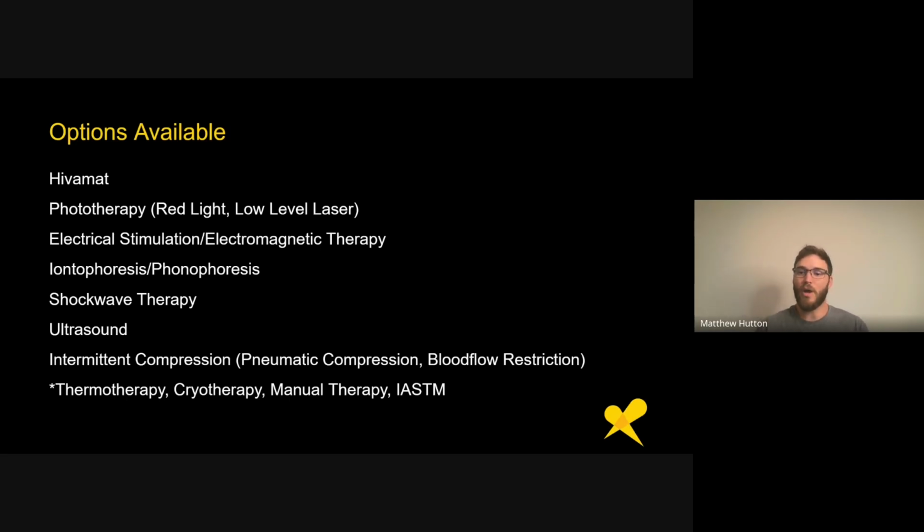If you come in with so much pain and you're like, all I can do is sit on a table, okay, we're not going to get too far with your rehab. We're going to do some mobility work, and that's about it. But if I can apply one or two of these modalities, get you feeling a lot better, trick your brain into perceiving that you're much more competent and able to move, now we go through your exercises, and that's what drives that rehabilitative process. I think that's spot on.